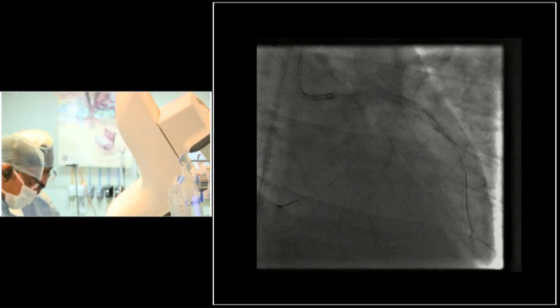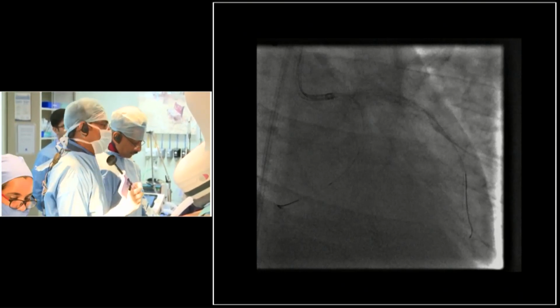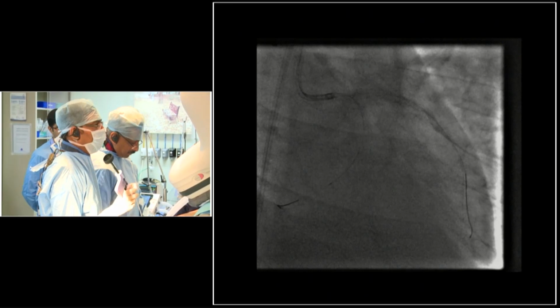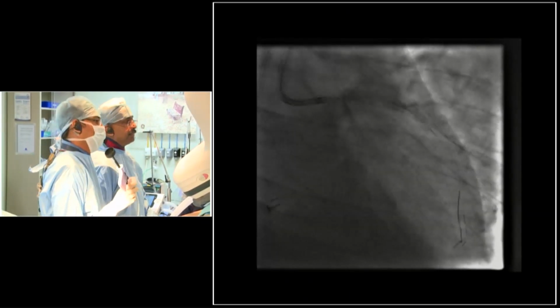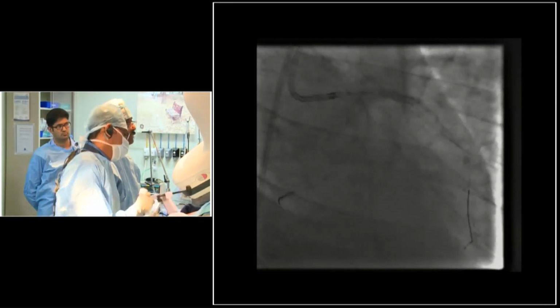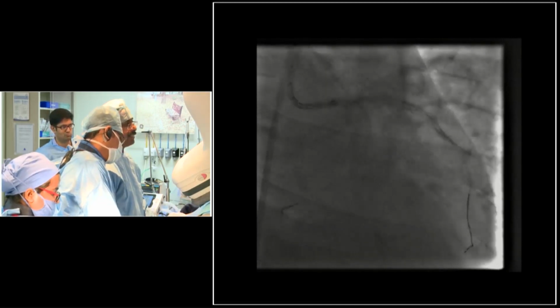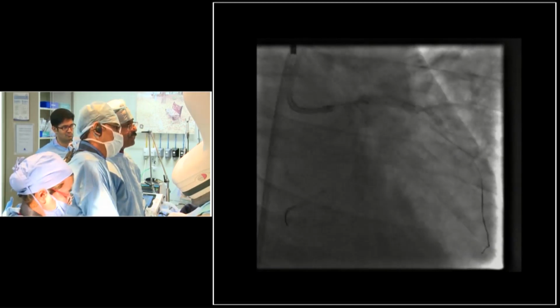Are you planning to remove the Circ wire, or are you going to proceed with POT and remove it later? Here, a lot of calcium. What do you think? With POT, it may get trapped. But in the left main we don't have much calcium here. But anyway, we can remove it. Maybe I can check the flow and remove it. Yeah, I think we'll remove it, because there's not much calcium in the left main part. The calcium was only in the LAD part.